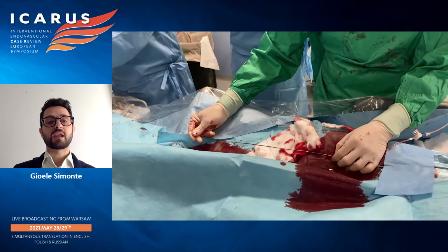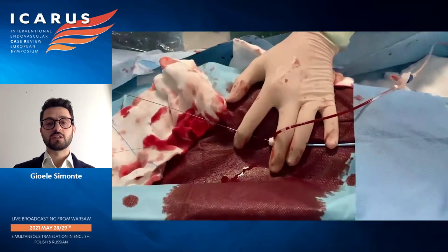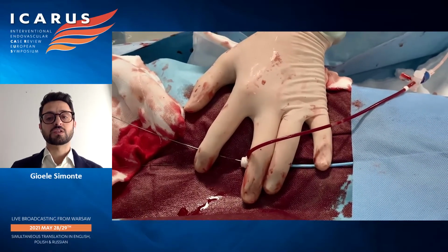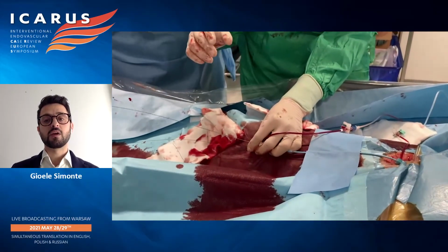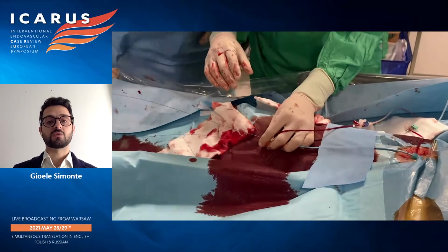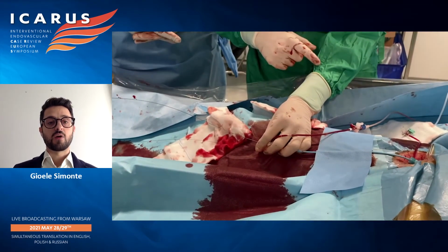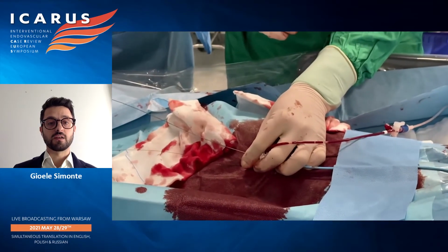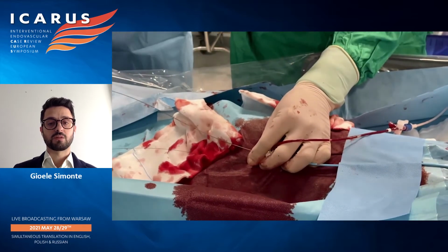We are really careful during this part of the procedure in checking for air embolism, and we stop several times during the stent advancement into the system to eliminate any gas trace from the line. See here our air bubbles are being eliminated from our line going through the T connector proximal to the valve.